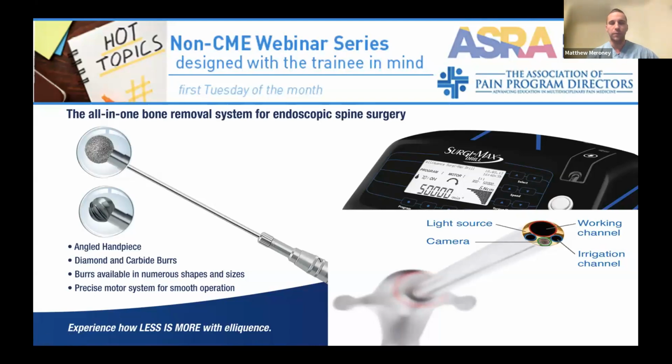And this probably will happen more and more in the future, but the carbide drill specifically can be used to treat areas that are being compressed specifically by metal. So if there is a pedicle screw that's jutting into a nerve root or a cage or something that maybe isn't placed perfectly or for some reason is causing an issue, you can literally use this drill to burr into a titanium cage.